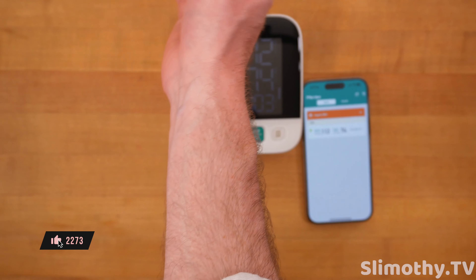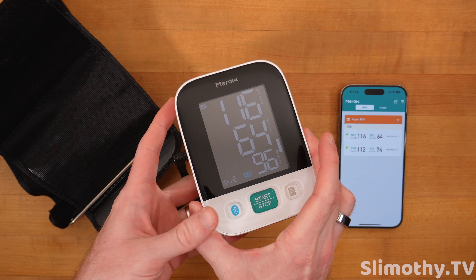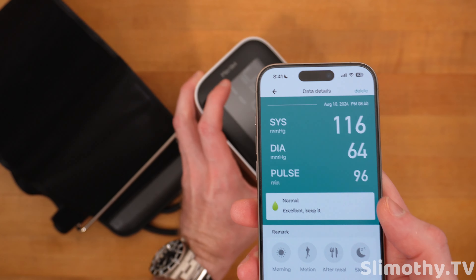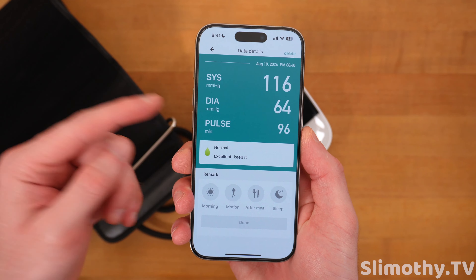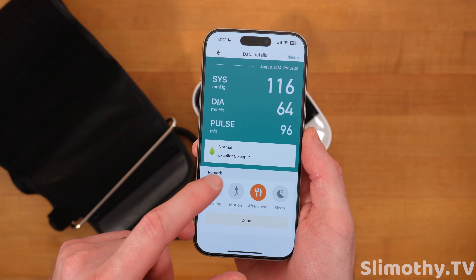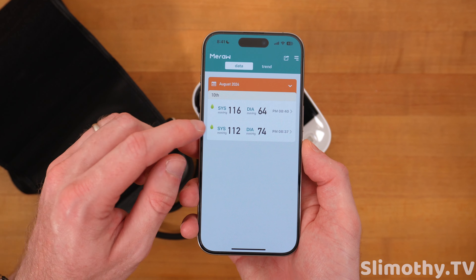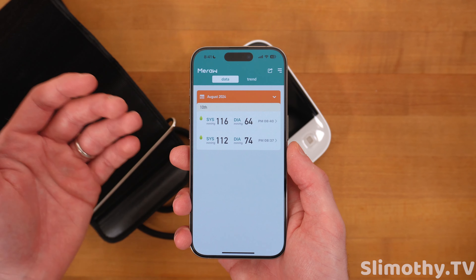That's a decent reading, but likely not exactly correct since I was standing. I followed their instructions and took a couple more readings. Here's one at 8:40 PM — 116 over 64. Drilling down: systolic 116, diastolic 64, pulse 96 — it says 'Normal, Excellent, Keep it up.' You can add a remark like 'morning' or 'after a meal' to use it like a journal, then hit Done.